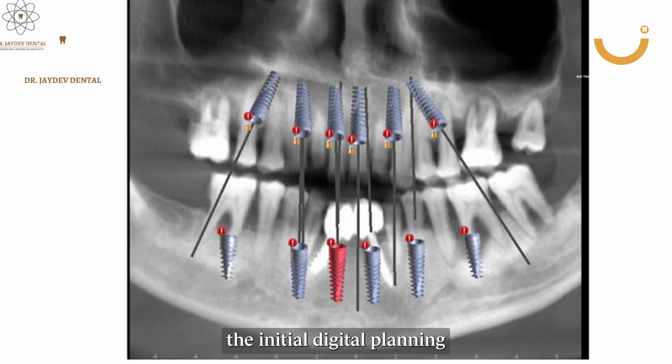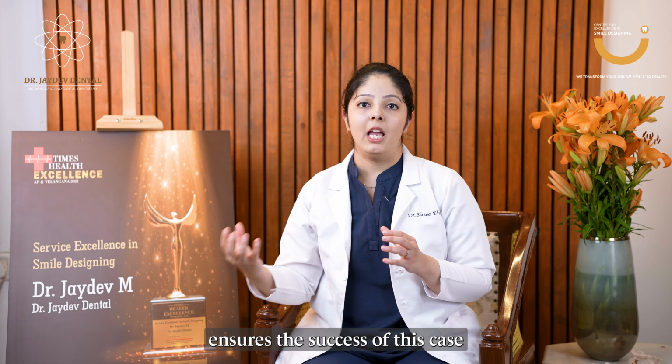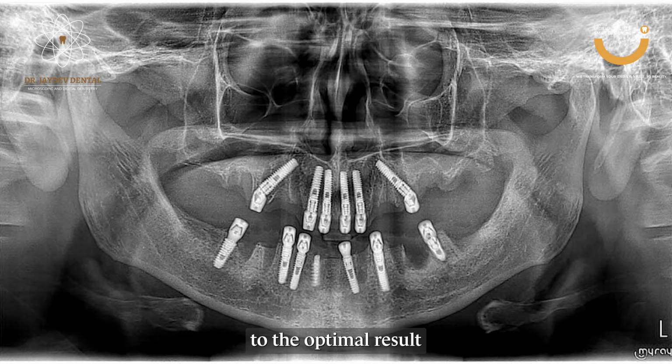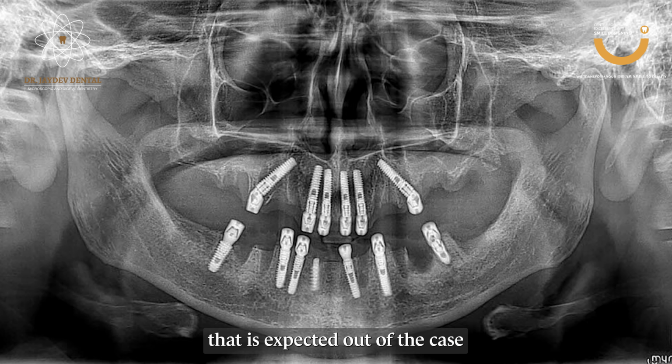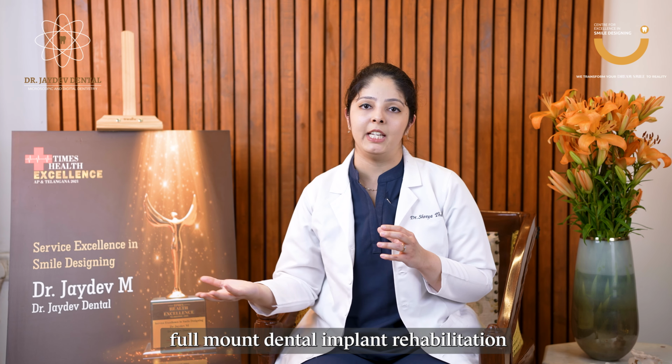The initial digital planning ensures the success of this case. The virtual planning leads to the optimal result that is expected out of the case. Planning plays a very crucial role in any case that is executed as a full mouth dental implant rehabilitation.